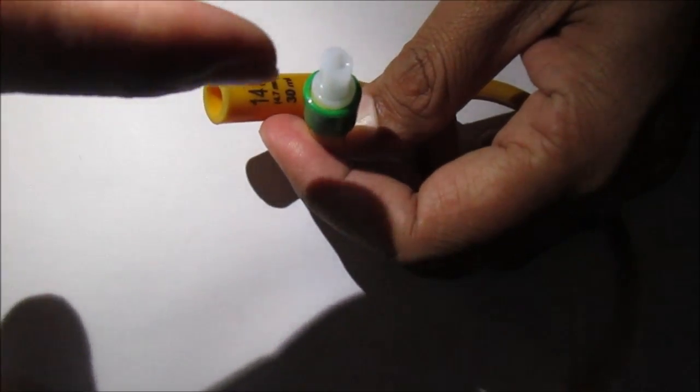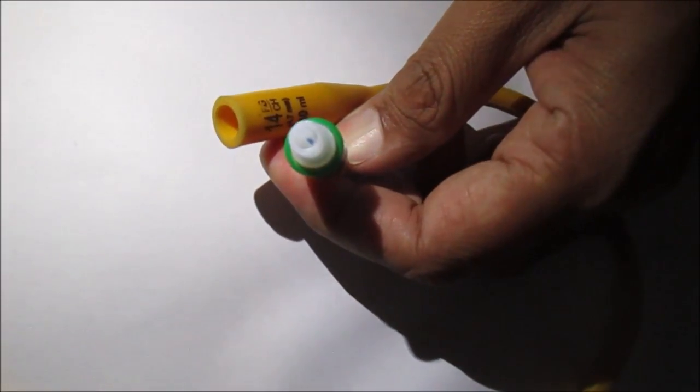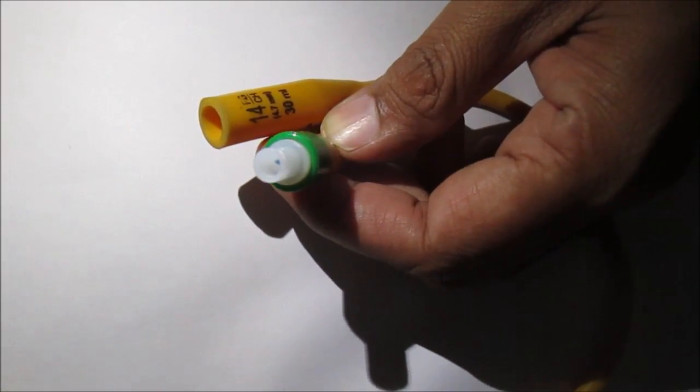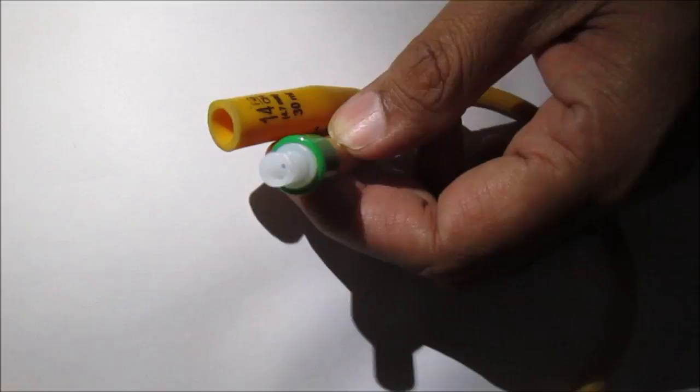If the valve is damaged, the balloon will be deflated instantly. The second approach is to take a guide wire and insert it in the Foley in the route, that is the pathway of the water.